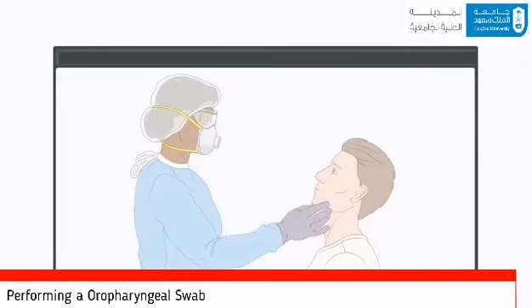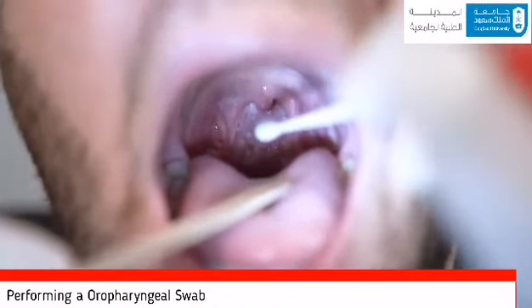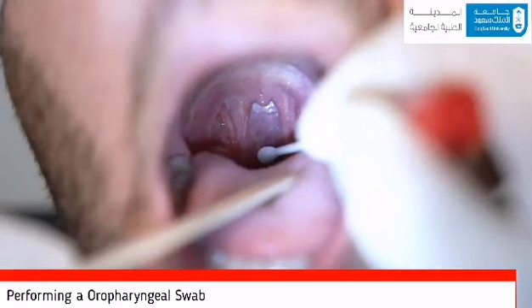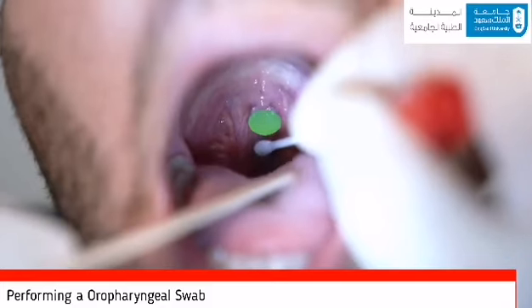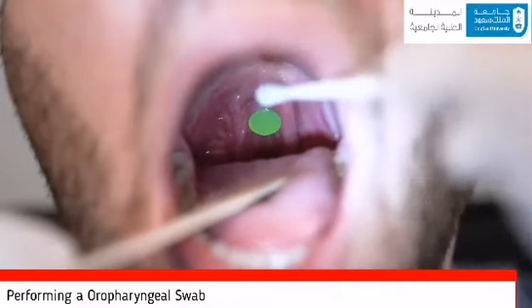Again, inform the patient that the test will feel uncomfortable for a short time and may trigger a gag reflex. Depress the patient's tongue using a tongue depressor. Gently insert the swab into the oral cavity without touching the lips, teeth, tongue, and gums. These surfaces should be avoided as they are colonized with a wide range of microbes. Collect the sample from the back wall of the throat. Twist the swab shaft gently but thoroughly, sampling the oropharyngeal wall and tonsillar pillar.